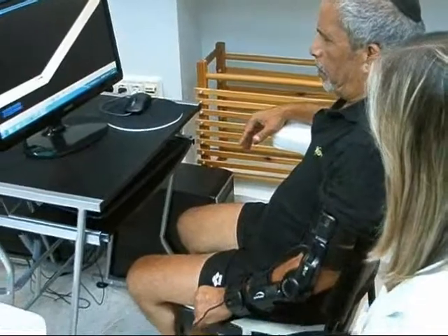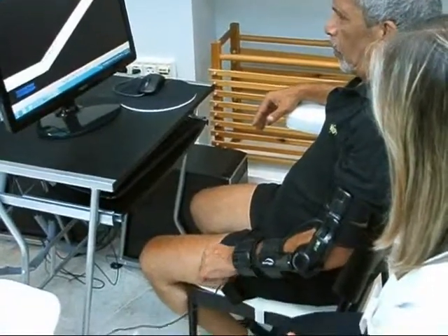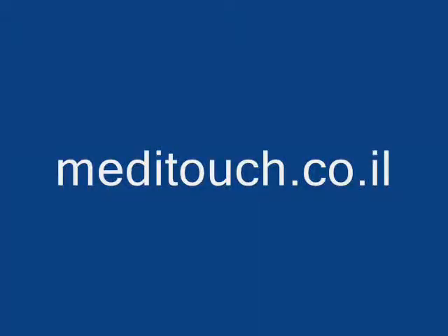The Arm Tutor system provides objective and quantitative evaluations on the patient's treatment progress. For more information, please visit the Meditouch website.